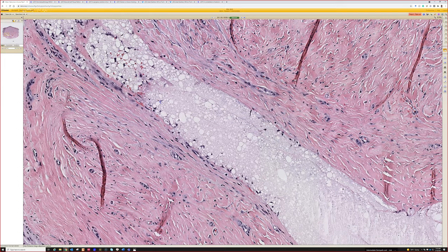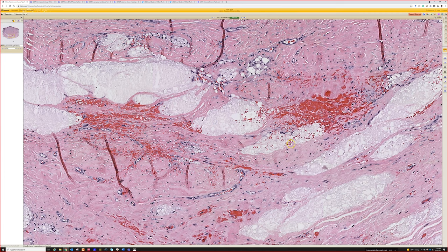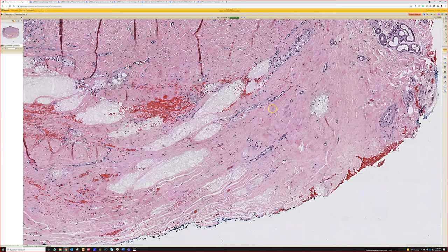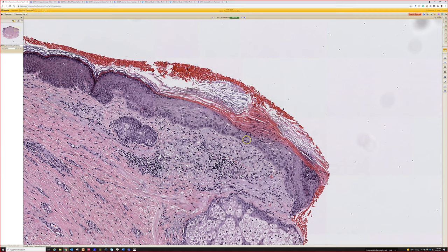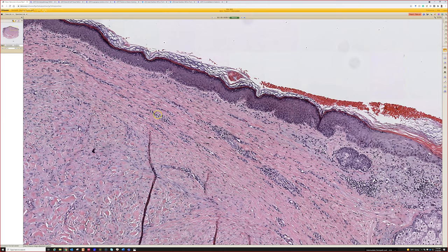You can find these a lot of times in excised keloids, because people often get their keloids treated first with injections and then maybe excised later. And there are also two other little bonuses. Up here we've got a little actinic keratosis — some jumbled atypia along the basal layer, but it matures to flat squamous cells at the top, with some parakeratosis over it. Maybe they had a squame or an AK excised here before.